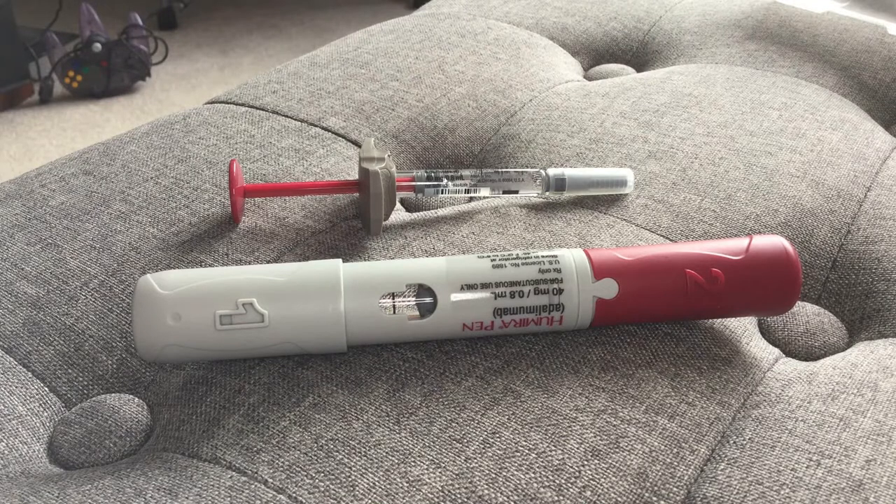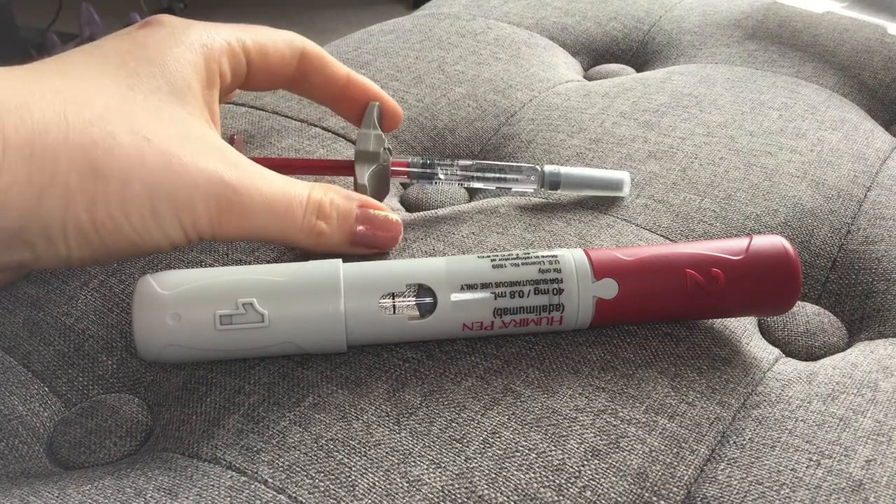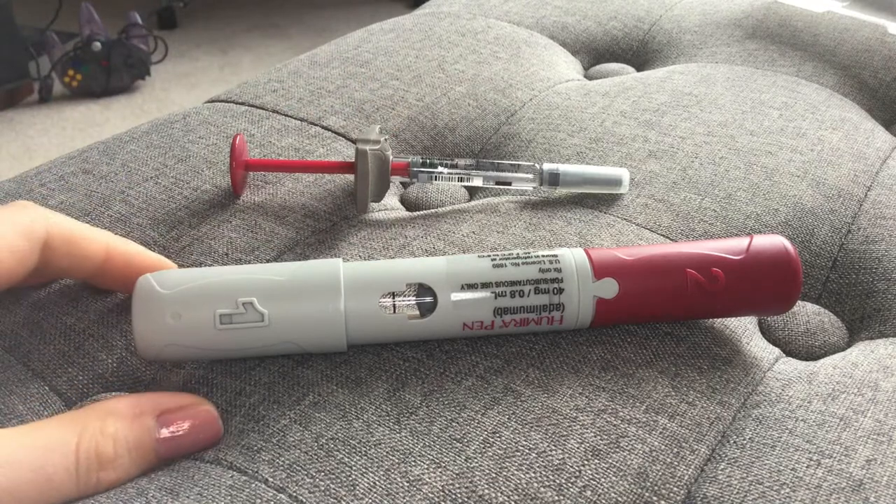A couple of things for you to know about each of these: they both have pros and cons, but I will say that I have a lot of experience using this kind of method and I prefer a syringe over an auto-injector pen, and I'll explain why.